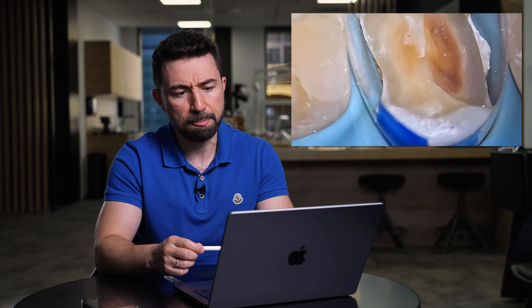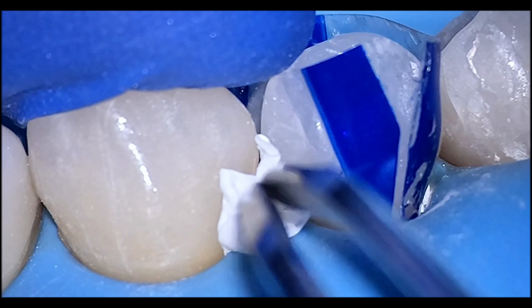In these kinds of cases, I prefer to use soft matrices, like transparent matrices, because they are much more flexible compared to metal ones and they are not as sensitive to so-called plastic deformation. The first thing I do is place the matrix, and then I use Teflon.